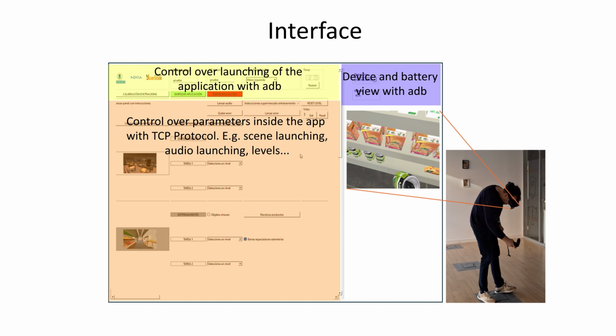In the visualization area, the therapist can see which device is connected, as well as the battery remaining of the device. Also, it has an area to mirror the HMD view, which is what the user sees. This is done through an open source application called Immersive and enables to mirror the HMD view through ADB in Python Qt. This enables the therapist to track what the user sees and does.